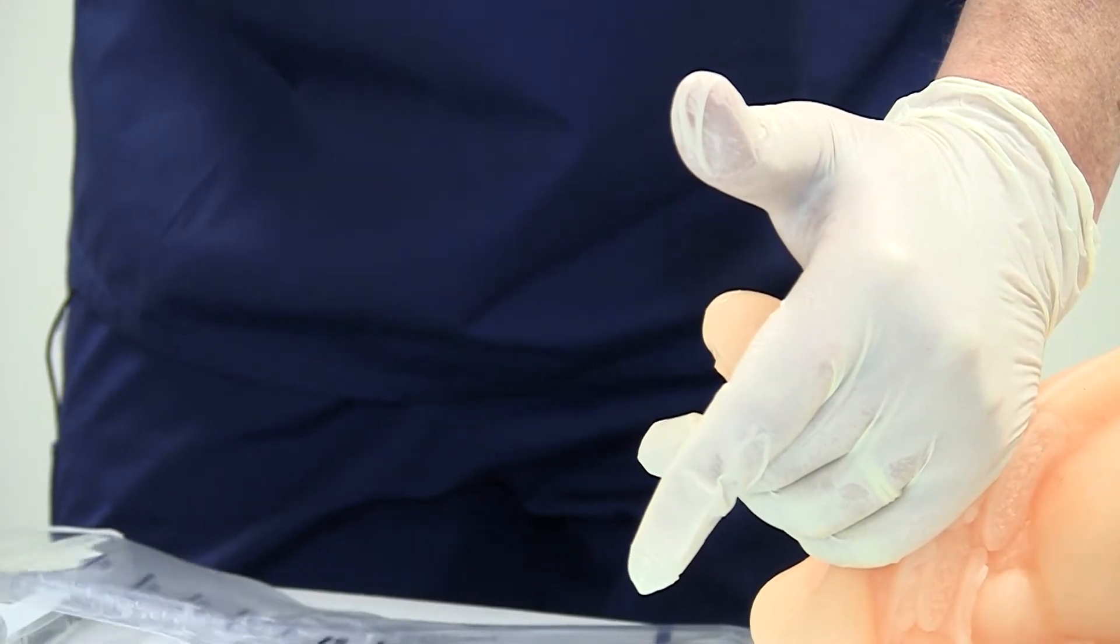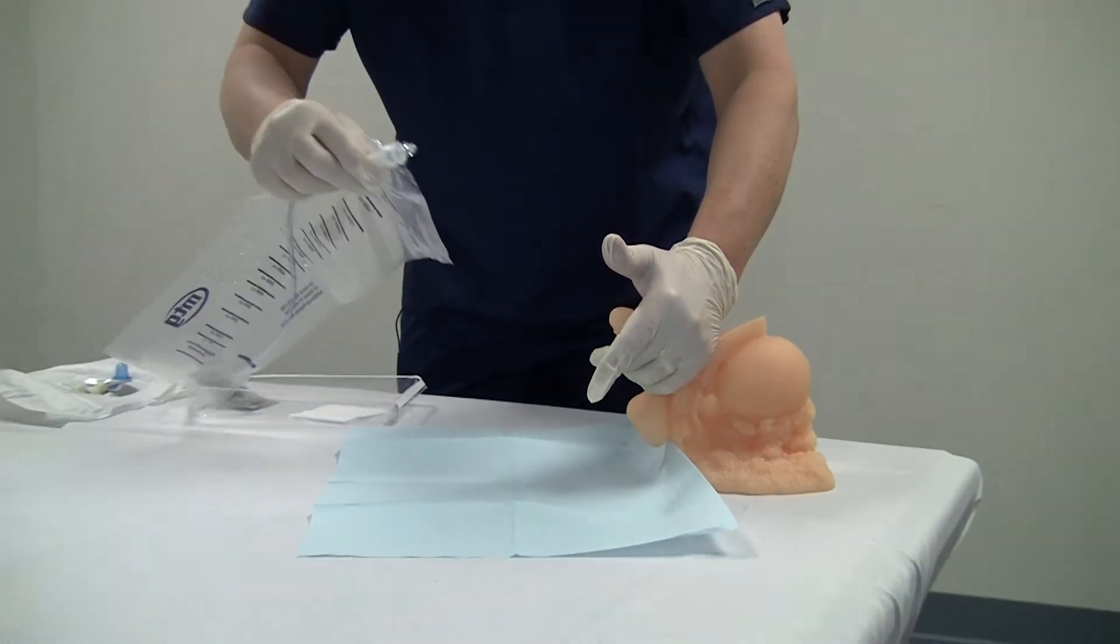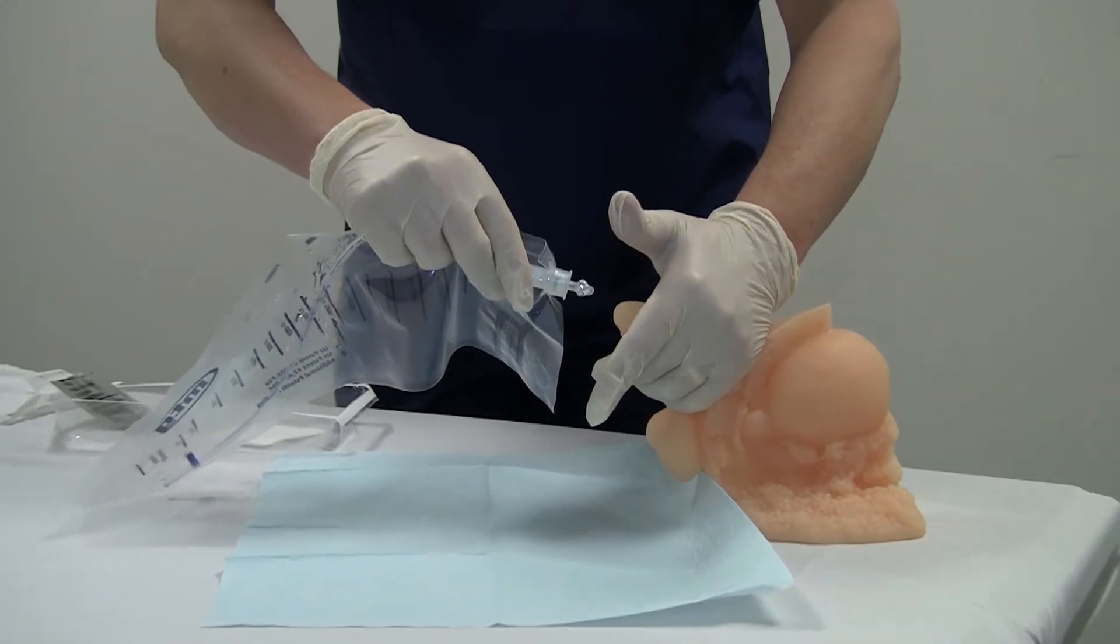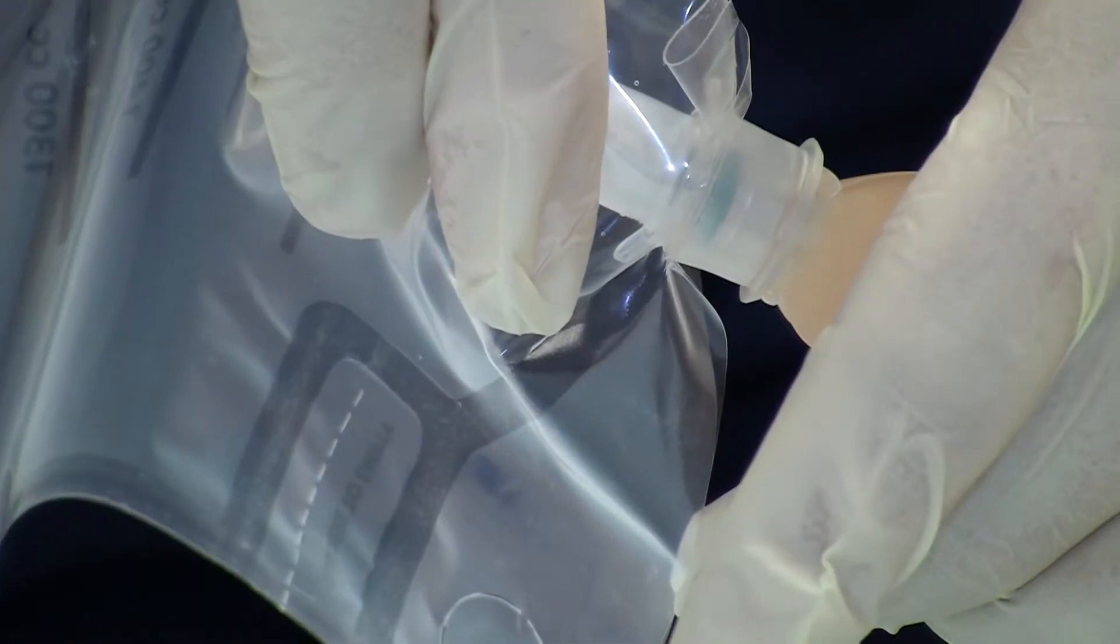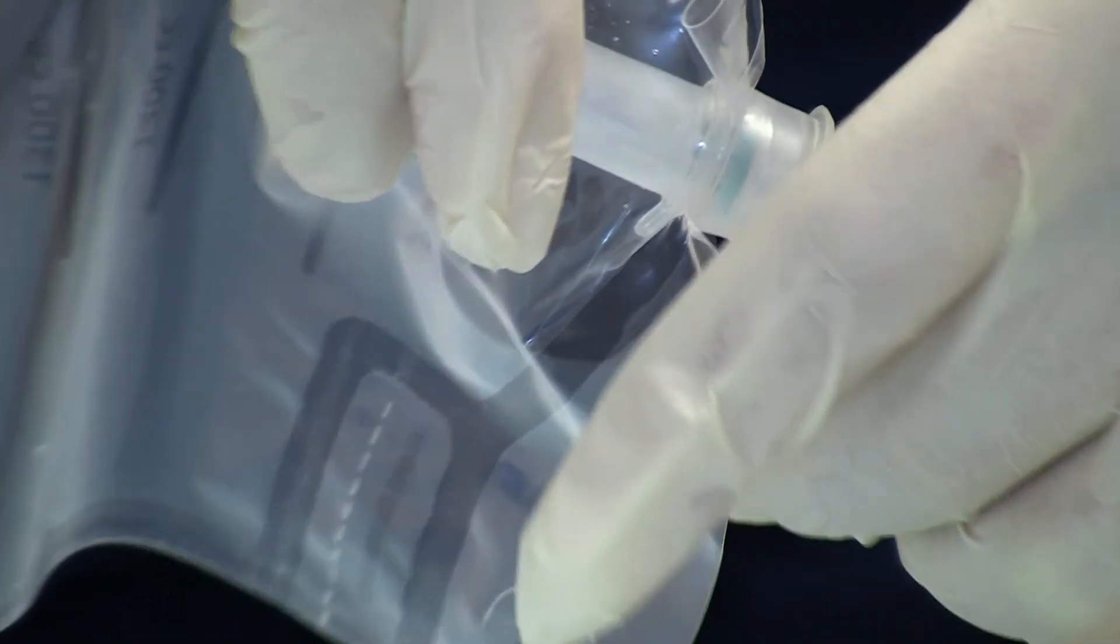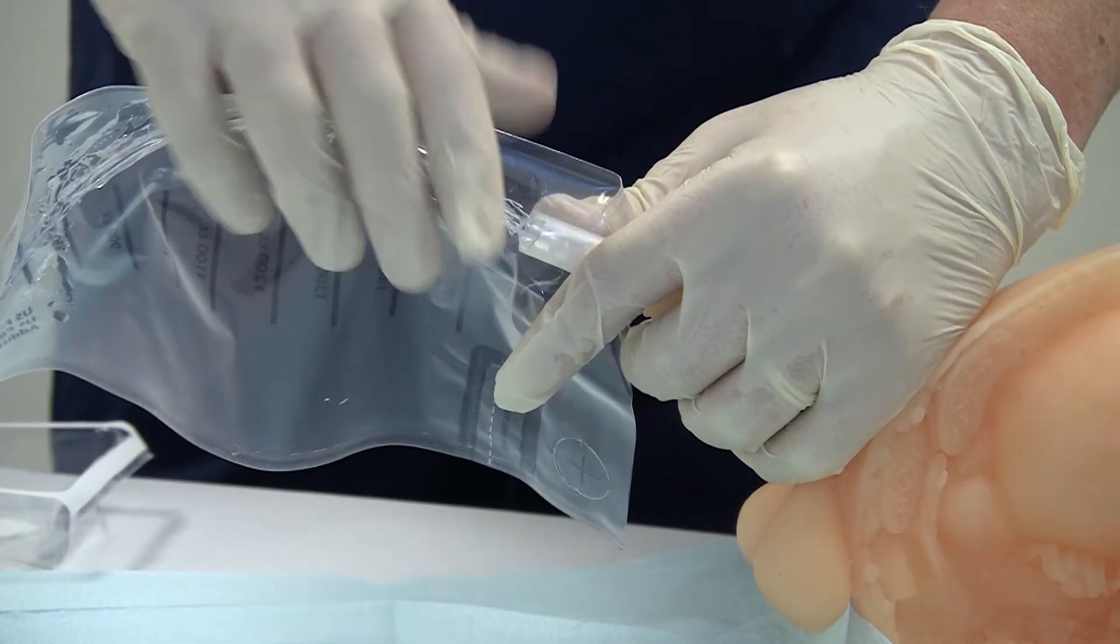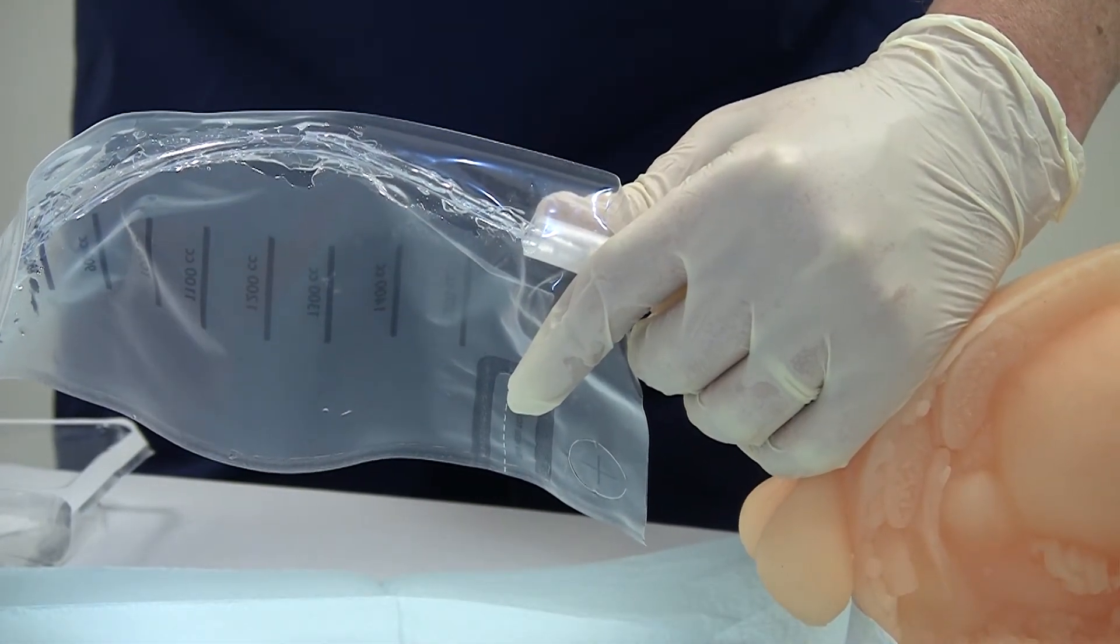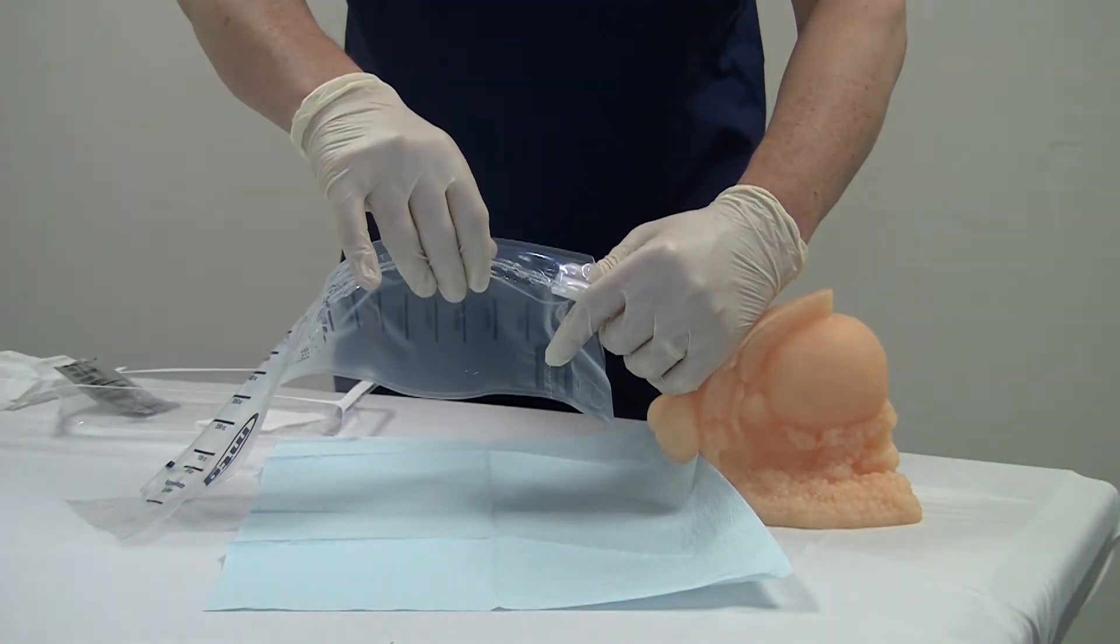Once we've prepped without letting go of the patient, I'm now going to reach back for our catheter. It's all pre-lubricated. I'm going to insert the catheter and the introducer tip in the urethra just like this. It should look just like this in the patient as it does in my hand and my model here. My thumb and my index finger I'm going to use to stabilize everything so I can let go of the patient with my right hand entirely.